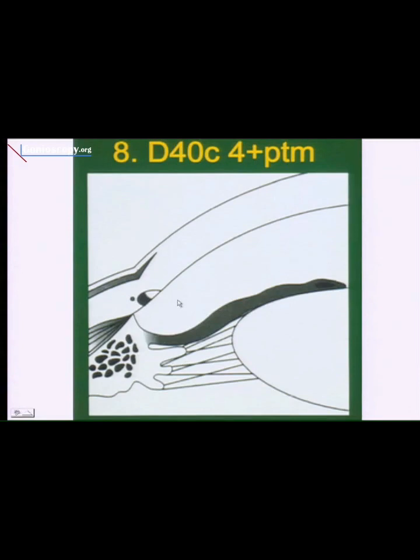So here's a patient now who, when you put the lens on, you can see this is deep. It's almost an E. That would be one of those places where you decide, well, is that a D, is that an E? It's certainly very deep. Along that line, who else has angles like this? In what sort of situation are you likely to see a very deep angle? Any patient who is a myope. Myopes usually have very posteriorly inserted angles. Hyperopes have much more anteriorly inserted angles.